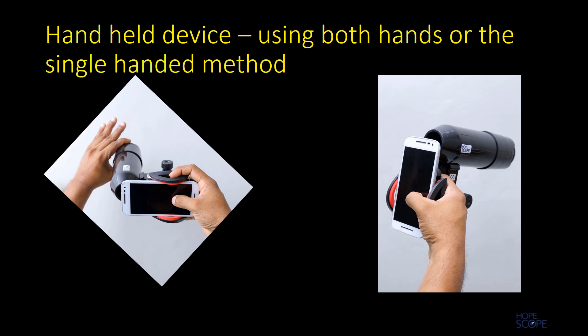The HopeScope can also be used as a handheld device. It can be used with both hands or with a single-handed method. When using both hands, one hand holds the lens holder and the other hand holds the smartphone holder and phone. With the thumb one can touch-focus as well as click to capture the image.